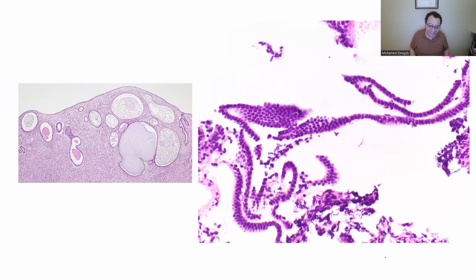Okay, what was this again? This is strips. I remember the strips and clips you said. Yeah, this is like the paper clip. Atrophic, yeah. And this atrophic is the Swiss cheese. Swiss cheese, yeah. The dilated Swiss cheese.